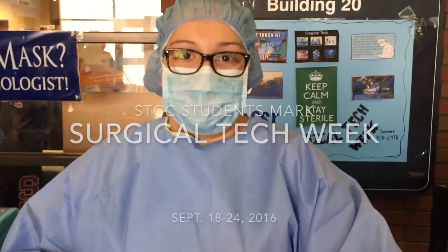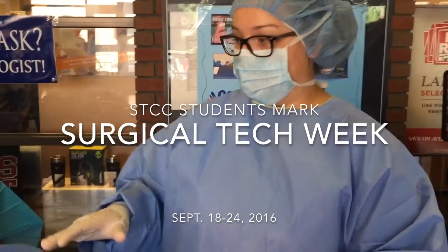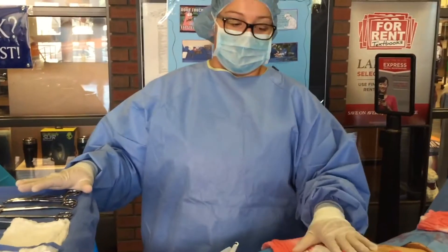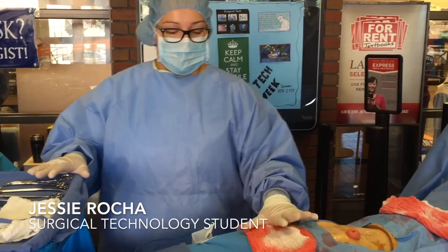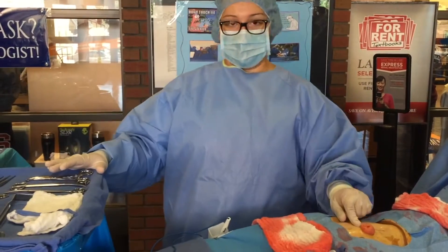Hi, I'm Jessie. I'm a surgical tech student and we're going to do a little demonstration, just kind of talk about our role and what we use all our instruments for. So this is our patient here. We're doing our removal of a stoma.